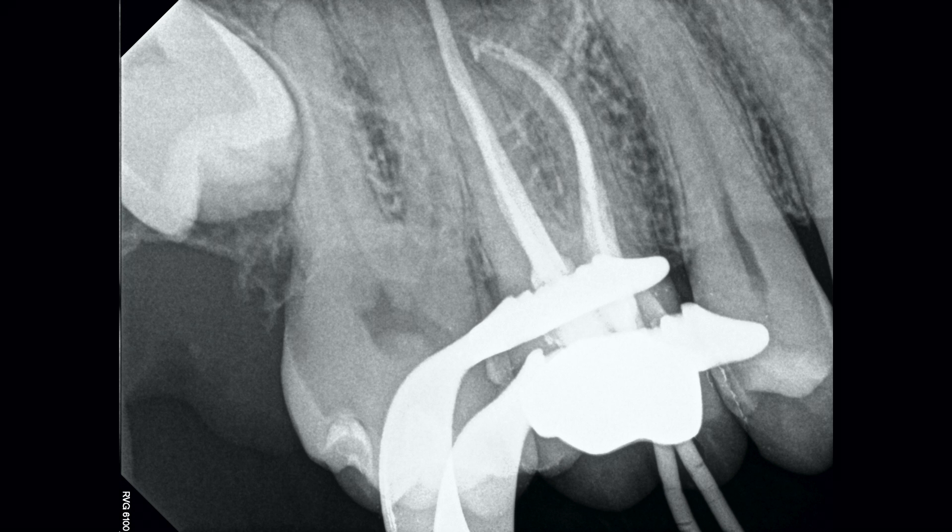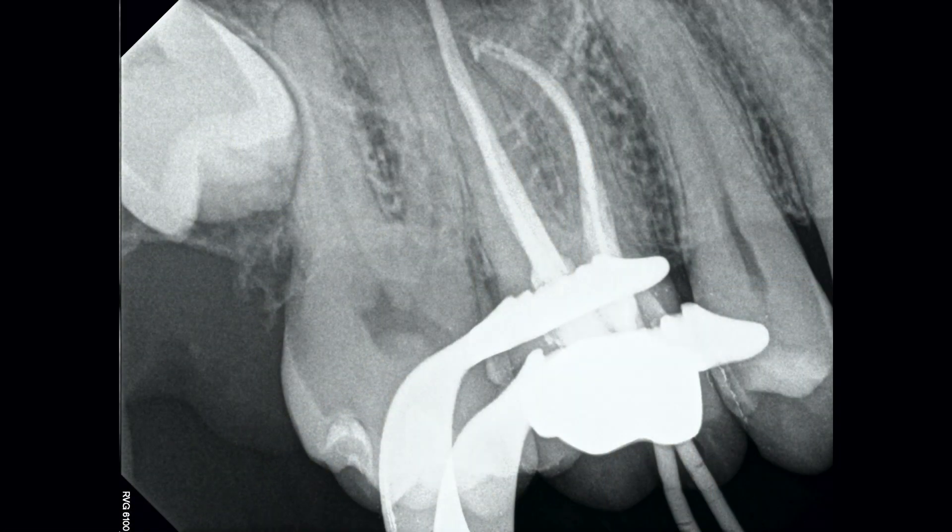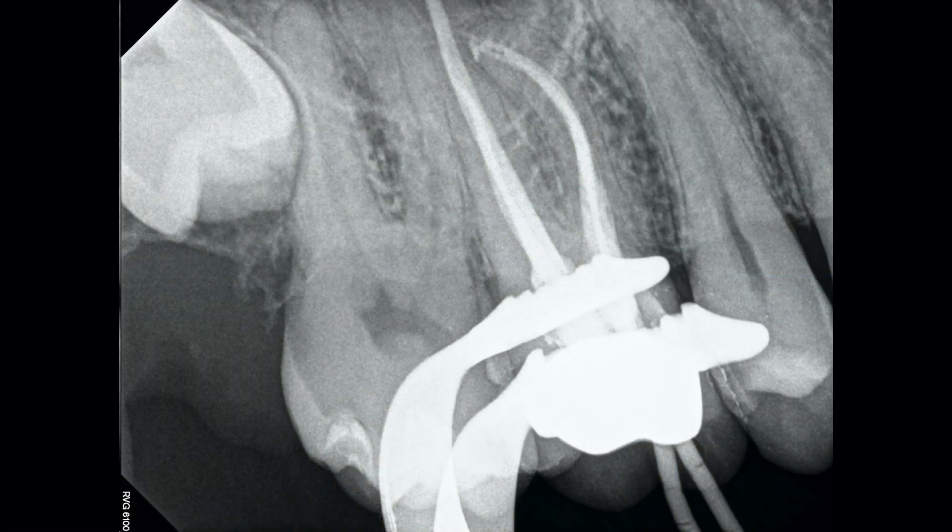After the MB2 has been fully shaped, I remove the material from the mesial buccal root system using a combination of rotary instrumentation and gutta percha softening agents. Once all that material is removed, we run through our disinfection protocols — in this case, the positive pressure irrigation technique. Once the area has been completely disinfected, the canals are dried and we move forward with obturation. My preferred method is single cone obturation with bioceramic sealer. I always encourage cone fit images to identify exactly where your obturation material is flowing. In this cone fit, I only want to see the mesial buccal root complex, and we can see two separate exit points on this mesial buccal root complex. I evaluate cone fit images for voids in the coronal, mid-root, and apical. If there's a void in the coronal or mid-root area, I may apply a little vertical heat to help the material flow into that voided area. If the void is in the apical third, I'll remove my cone, re-inject my sealer, and try again.